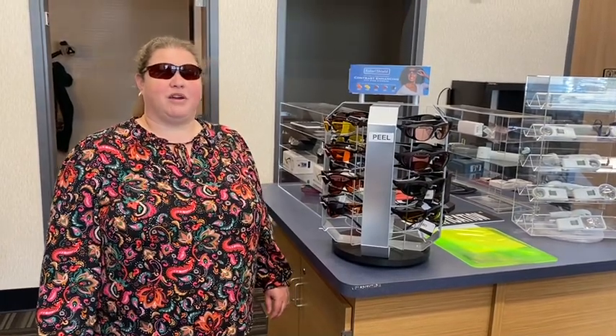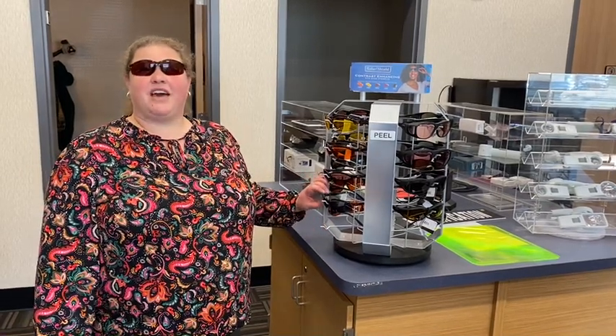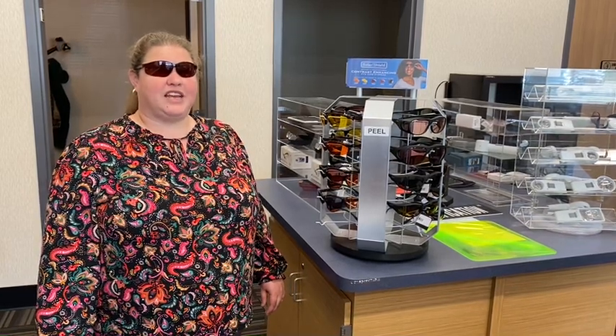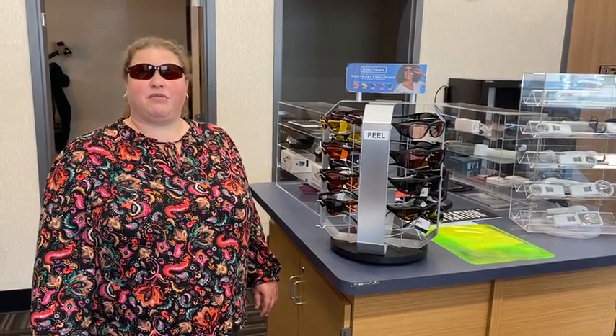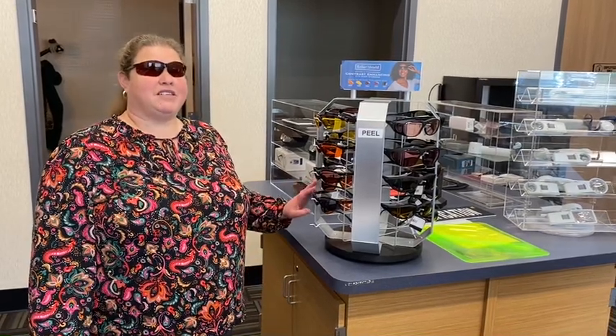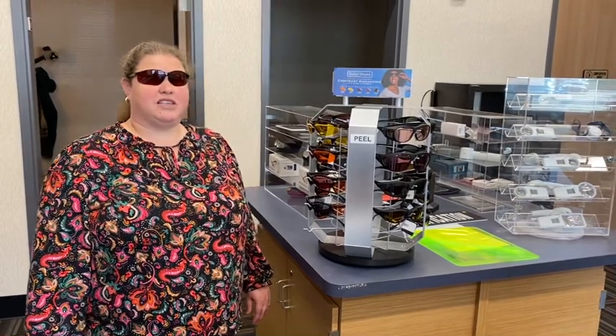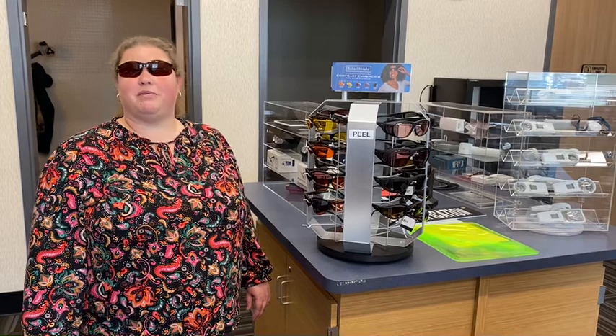I am wearing a pair of the Solar Comfort color shields — the Amber shields, which are the color of my choice. I've really enjoyed having those. These shields are for people who want to optimize the vision they do have. They can help you in different light settings to see a little better or eliminate some of the light, whether you are indoors or outdoors, to help you better see in your environment. They are not just for people with lots of vision, but even people with low vision, such as myself, can find some comfort from minimizing some light.